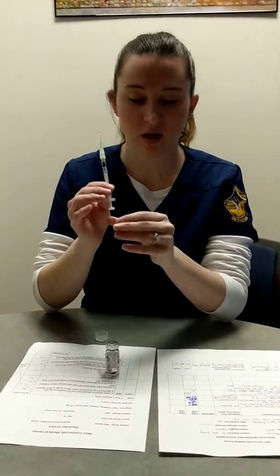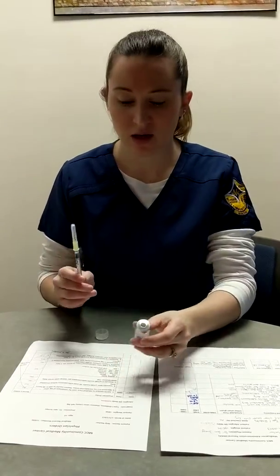Alright, and then we would label our medication with the name of the medication, the Mantoux, 0.1 mL, and then we would double check our MAR, 0.1 mLs, and then we'd go and give our injection. Let's go find our patient.